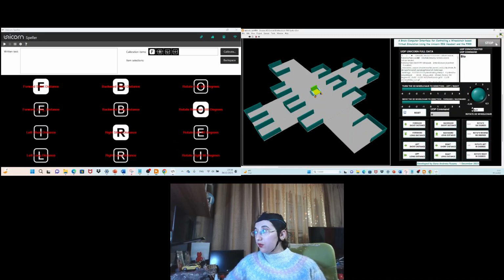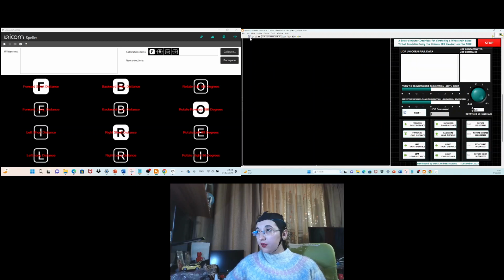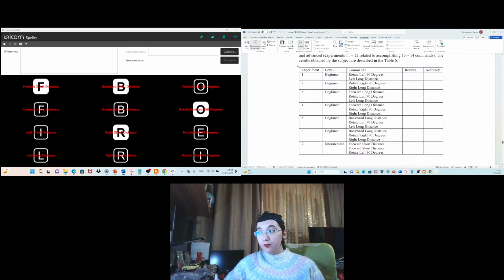Okay, so here I will restart the LabVIEW application. Okay, and now I want to perform the testing phase with the real commands. So let's begin. Let's start with the 6 experiments for the beginner level.